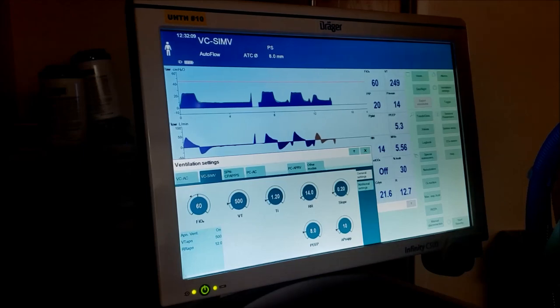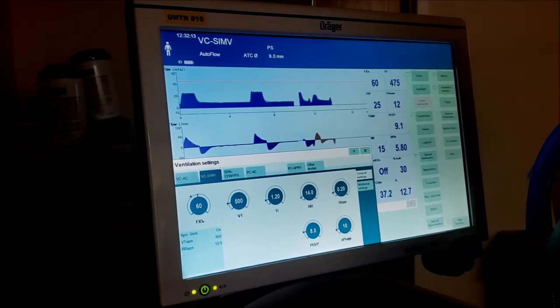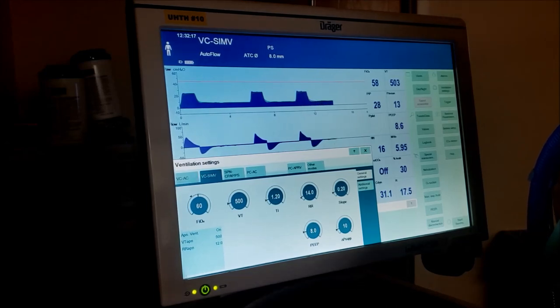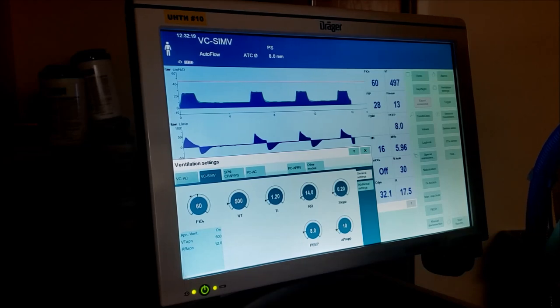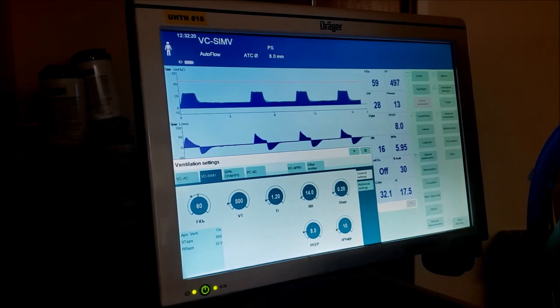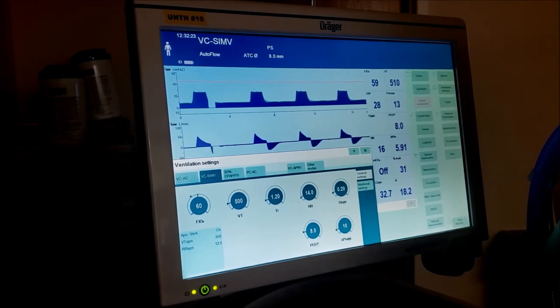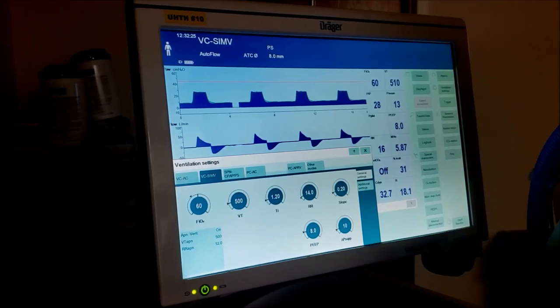This is a middle mode between assist control and CPAP and pressure support. We don't use it a lot, but it's one where they can breathe more on their own. Remember, assist control - they can breathe on their own but we are going to finish every single breath. It's really important when you're resting the patient to have assist control. SIMV has a tendency to wear patients out.